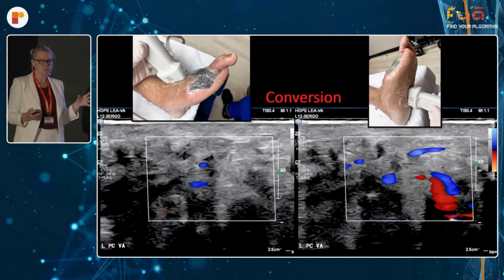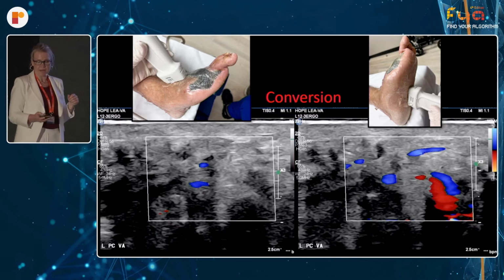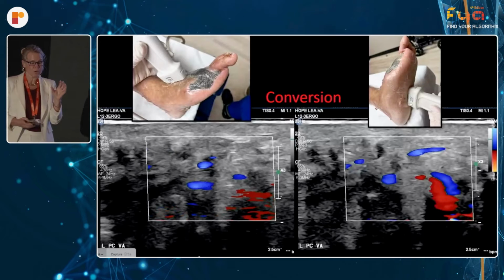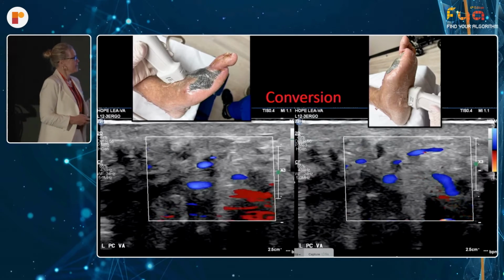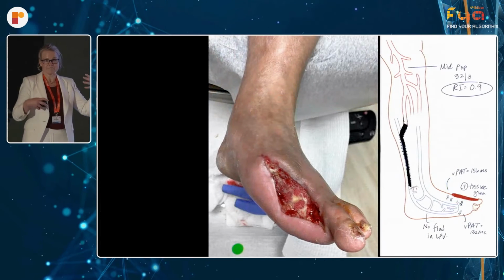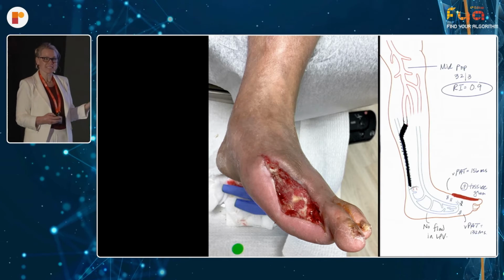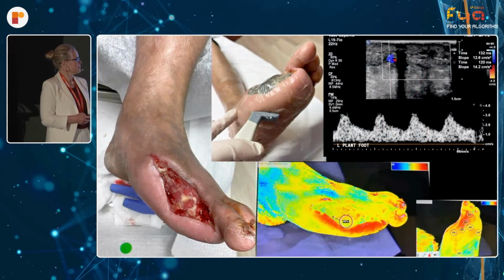This is the use of duplex ultrasound. This patient had a DVA open for about 5 months, and of course it went down. And this is looking at the superficial arterialized pedal venous flow with duplex ultrasound. This patient has converted, and this means that this patient has enough unnamed arterial flow to the wound bed. Look at this tissue granulation. The venous PAT is class 1. And you can see the rise time of the waveform.